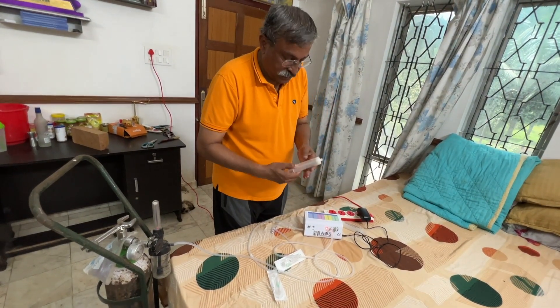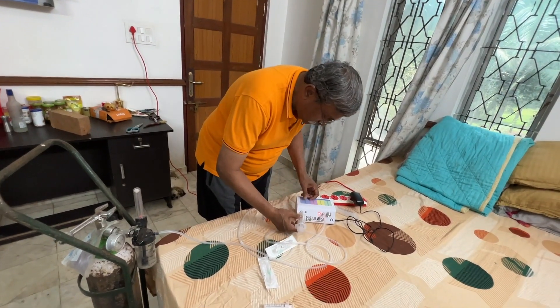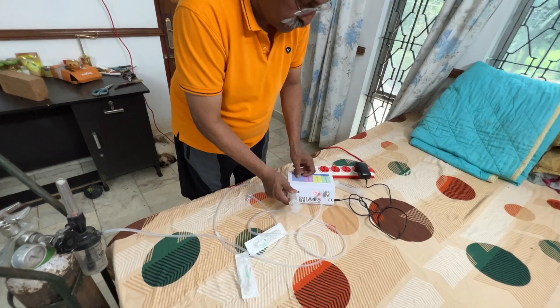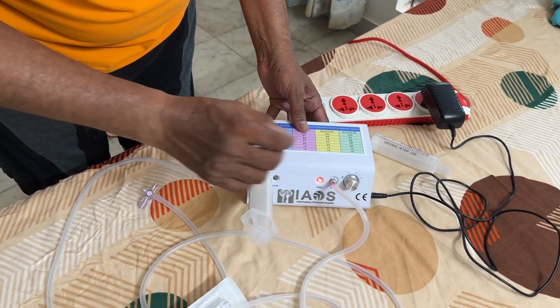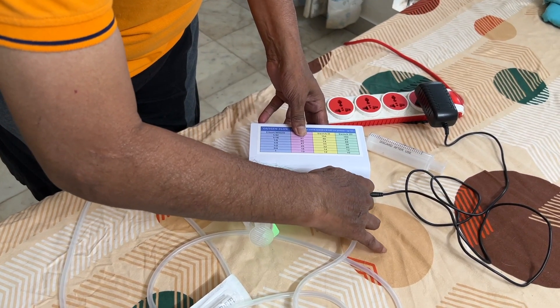These are special syringes, either plastic or silicon, without latex, which reacts with ozone. The syringe can be fixed to the lower attachment of the machine, and this is the chart that tells us what percentage of ozone comes out depending on the flow of the oxygen.